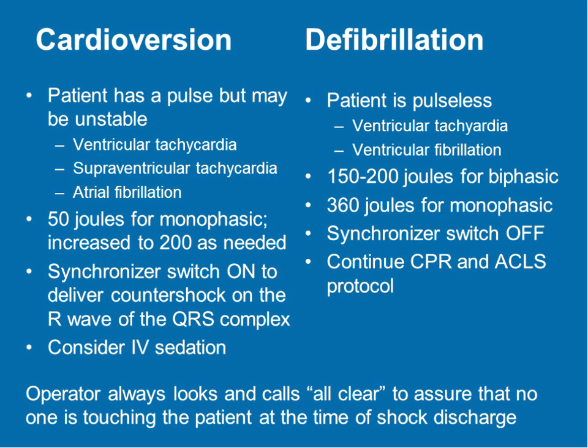Okay. Now, cardioversion and defibrillation. Cardioversion is also called synchronized cardioversion. Synchronized cardioversion and defibrillation is accomplished by sending a DC current through the heart sufficient to depolarize the myocardial cells, so that the repolarization that follows allows the SA node to resume its pacemaker role.